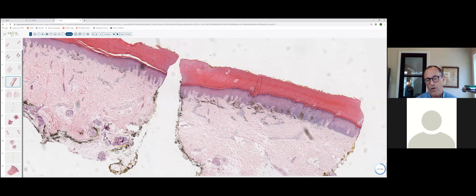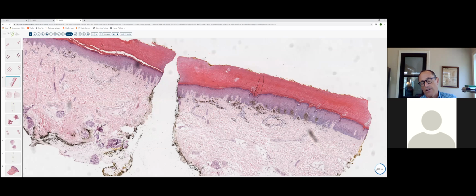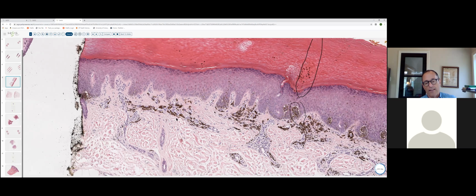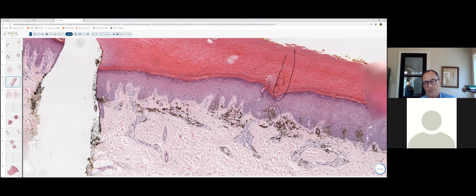And the reason it's so important on these acral biopsies of volar skin is that there's a lot of histologic overlap between melanoma and nevi on volar surfaces. Now, if I begin to see melanocytic nuclei that are large, and particularly if they're hyperchromatic and surrounded by a halo, if the patient's a little older, if I begin to see inflammation, then I begin to get a little more worried, especially if the lesion's recent onset and large, I'm more likely to get more levels and/or stains to try and assess architectural features.